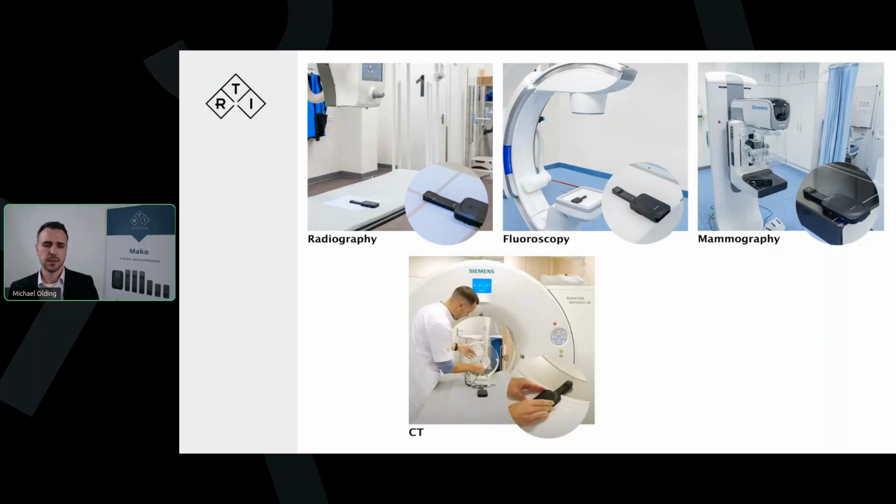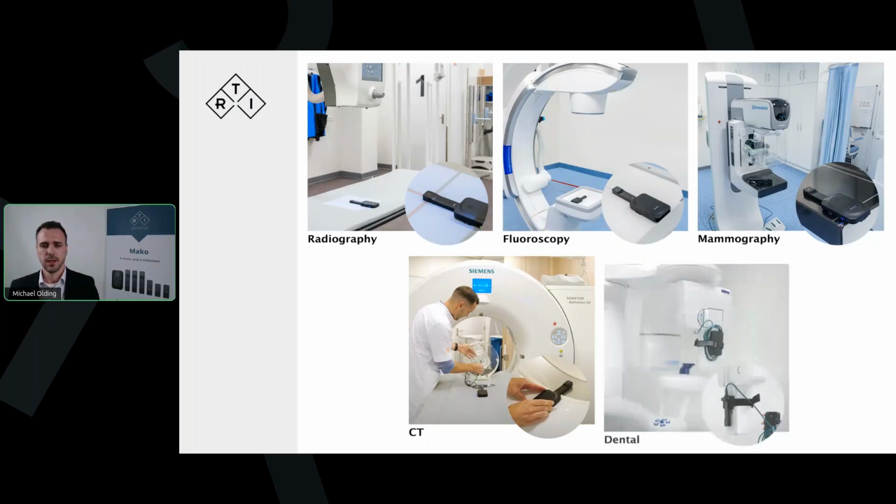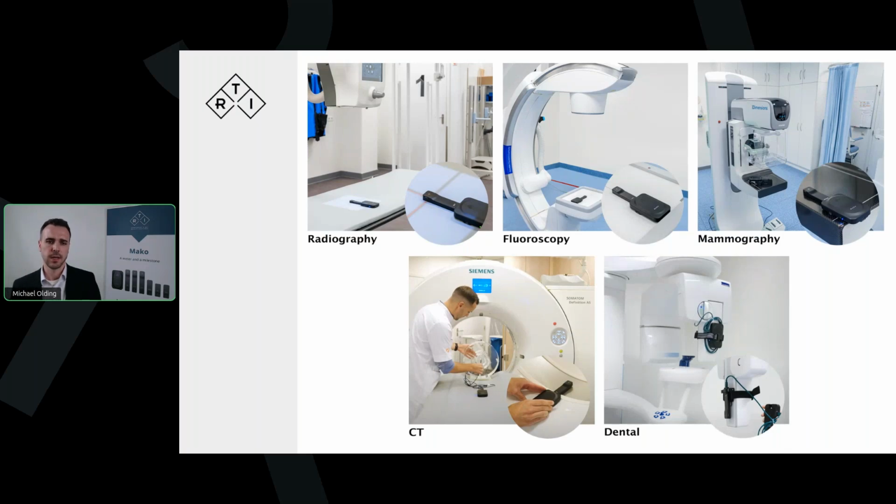Then perhaps consider the most complex. We're going to look at computed tomography, or CT, and how we do testing in that environment. And finally, we'll look at RTI Mako in X-ray dental applications.